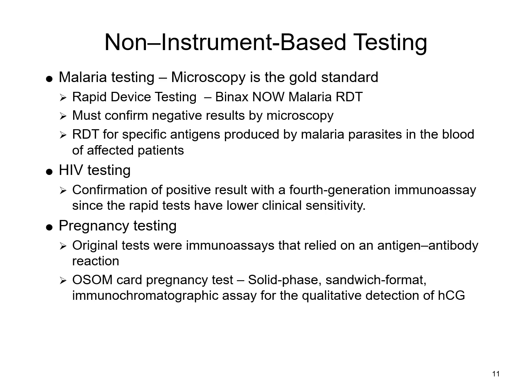I don't know that this would be very cost effective, other than it would allow a rapid screen and less tech time looking at the microscope. Particularly in our areas, although malaria is starting to be seen more in the U.S., you're most likely going to have more negative than positive. So again, I would rather just look at it under the microscope.